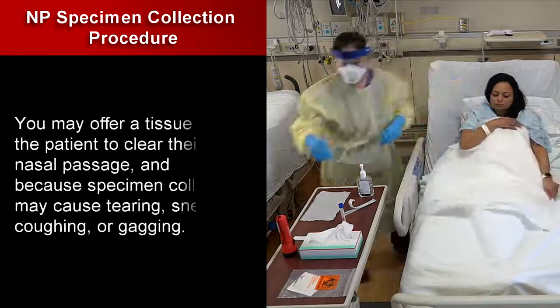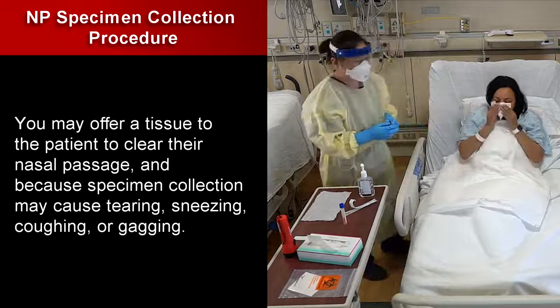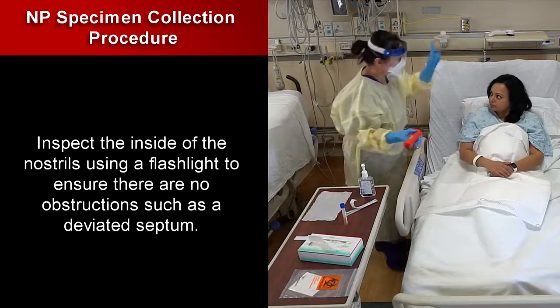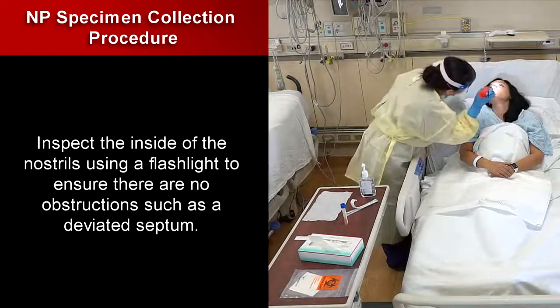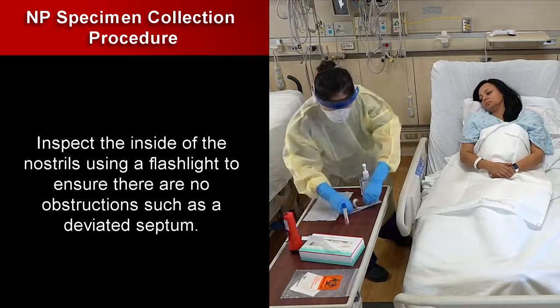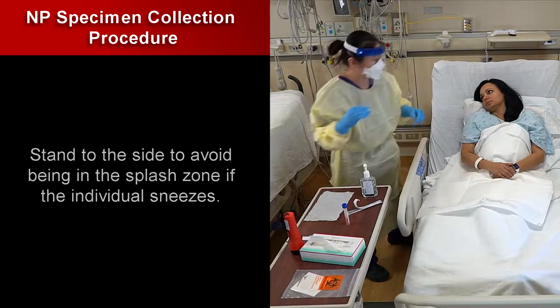You may offer a tissue to the patient to clear their nasal passage, and because specimen collection may cause tearing, sneezing, coughing, or gagging. Inspect the inside of the nostrils using a flashlight to ensure there are no obstructions, such as a deviated septum. Stand to the side to avoid being in the splash zone if the individual sneezes.